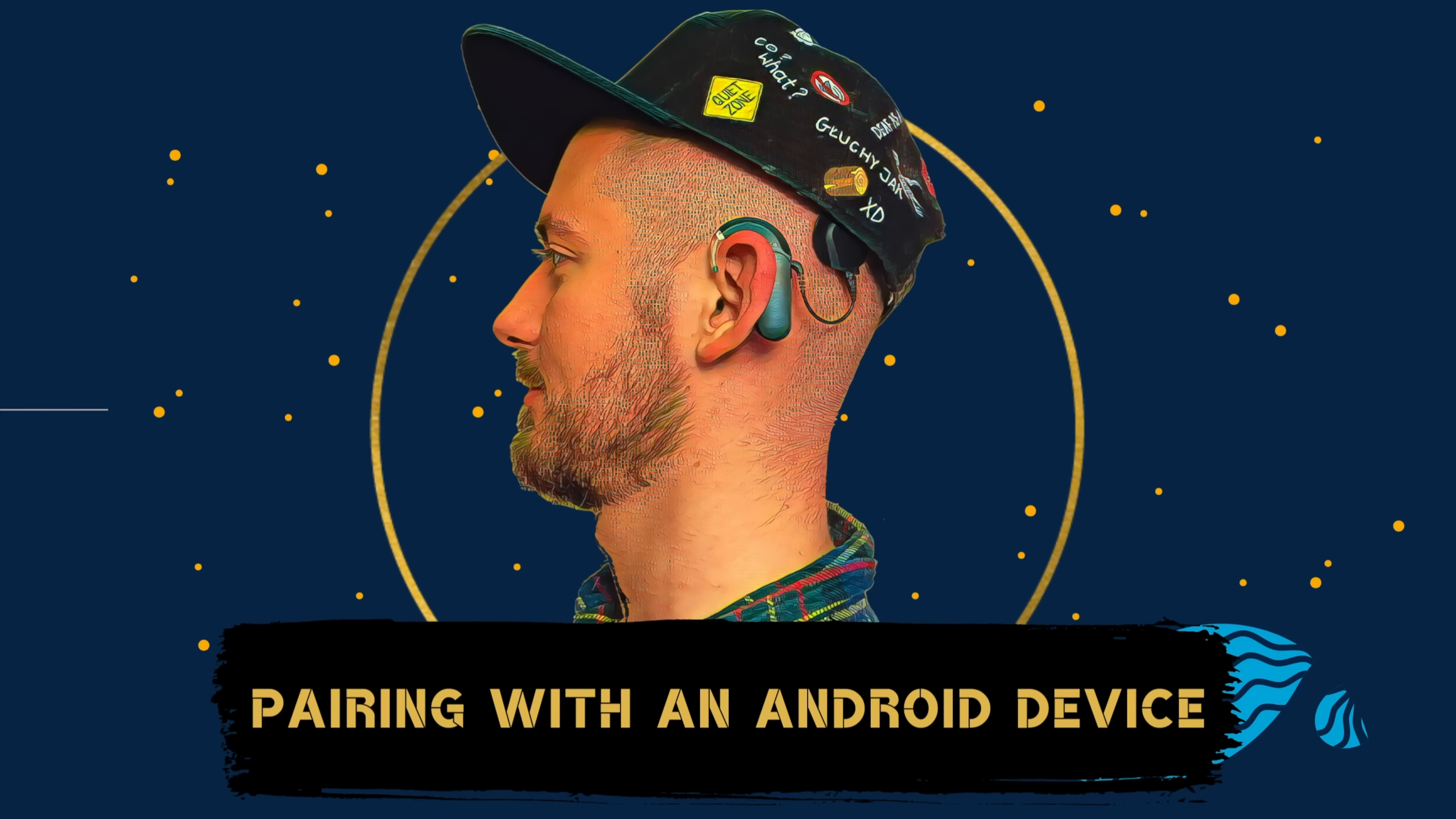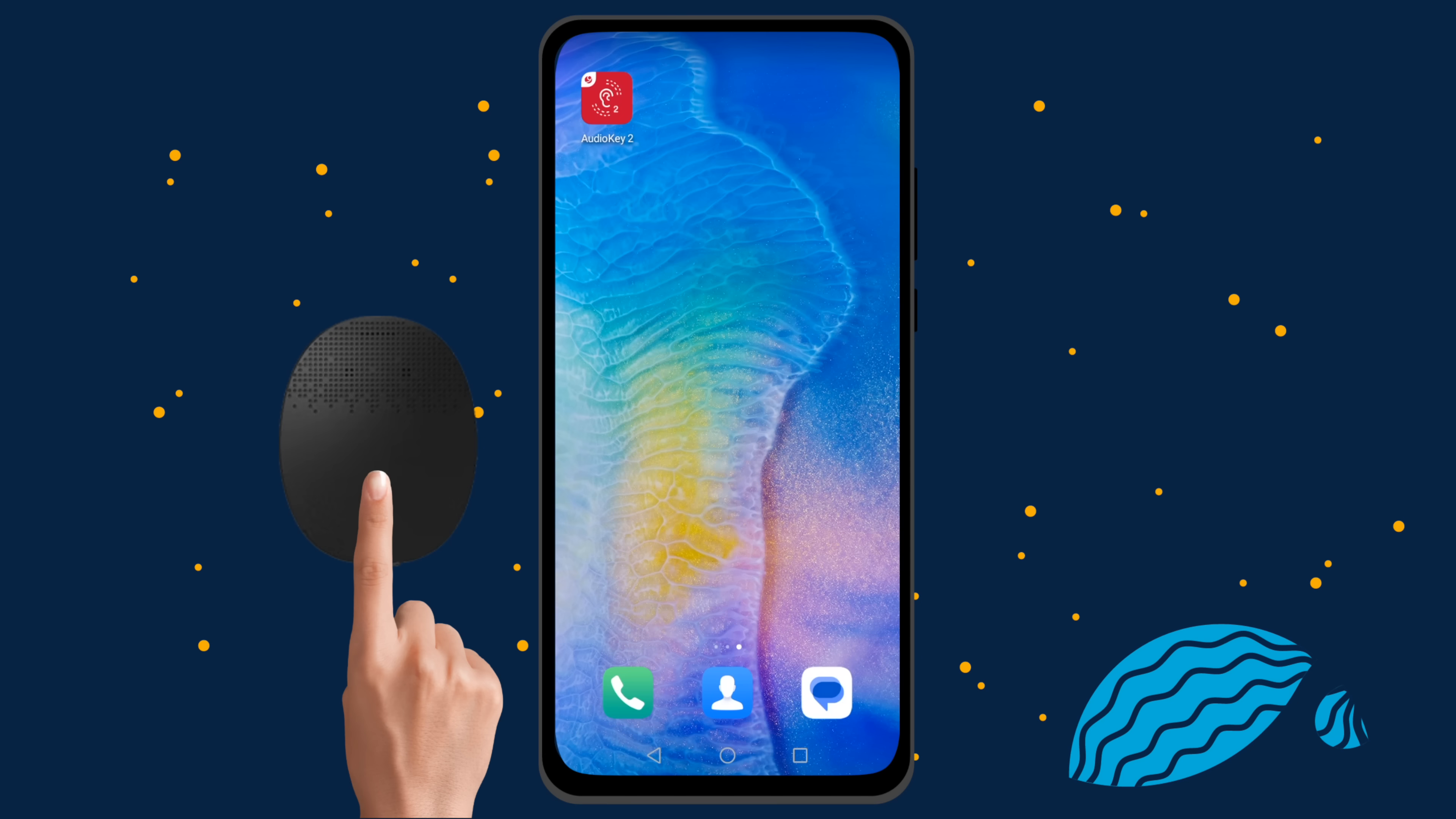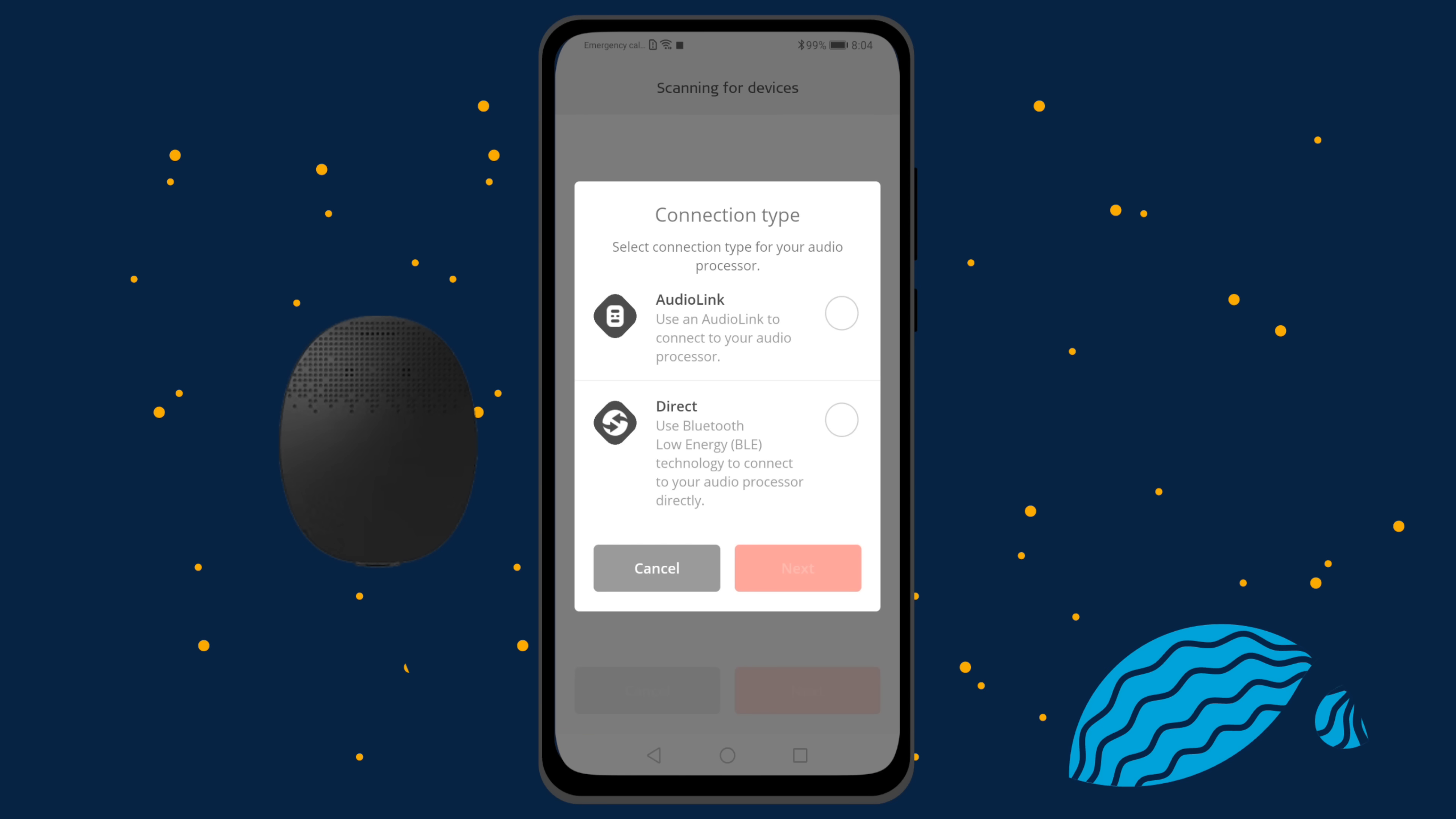Now I will show you how to pair your Rondo 3 with an Android device. If you are using Audio Key 2 with Rondo 3 for the first time, make sure that you have Bluetooth enabled on your phone. Then select the Direct Connection option and tap Next. Audio Key 2 will automatically pair with your device.